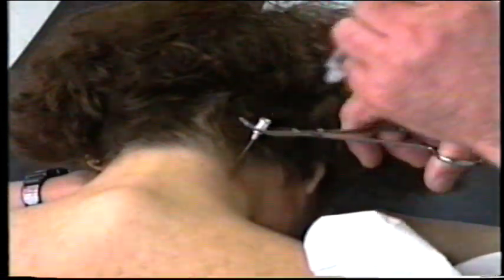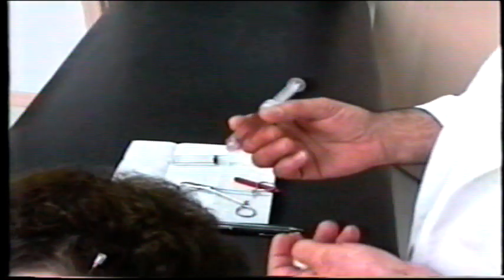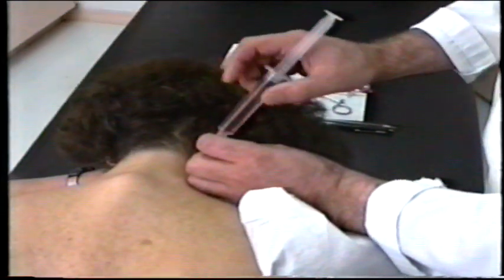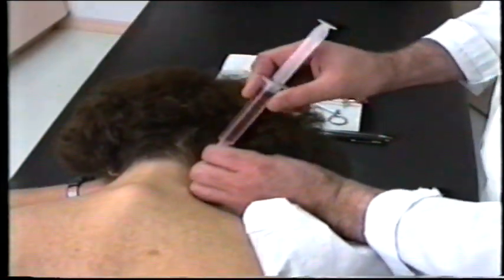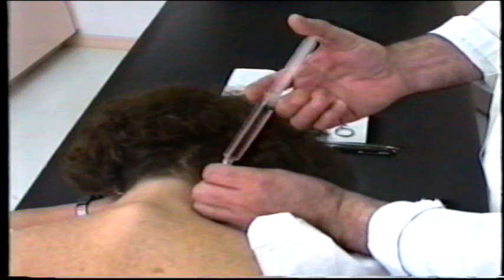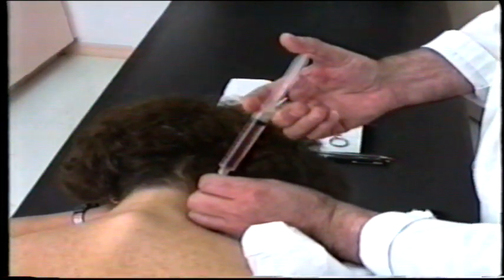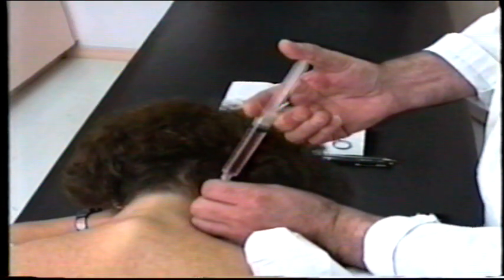I'm disconnecting the syringe with local anesthetic and connecting the syringe containing a combination of Hackett's solution mixed in equal parts with Marcaine, 0.5%. At this point, approximately 1 cc of this solution is being injected to the facet joint on the right side.